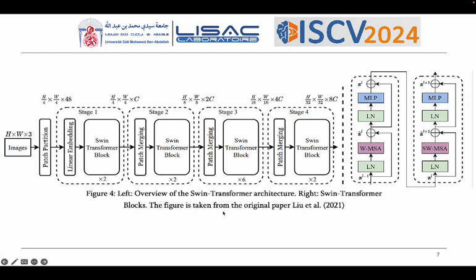After the vision transformer was introduced in computer vision in 2020, the main limitation of vision transformers was that they have quadratic complexity, which requires very large resources.